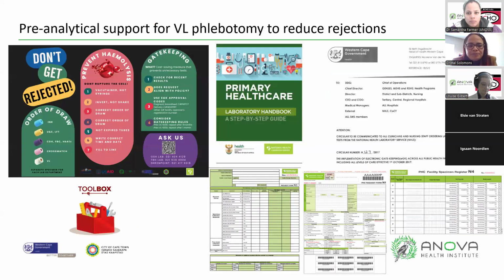And then, like I said, as Anova, we funded the support of the CLI program. So we looked at what the pre-analytical support, specifically around viral load phlebotomy, to reduce rejections would look like. And I think this is what I regard as a toolbox.